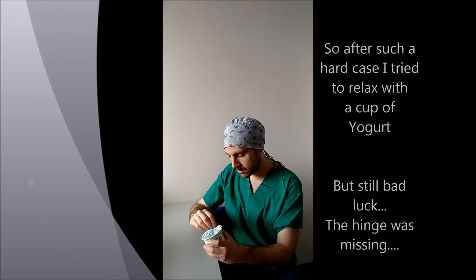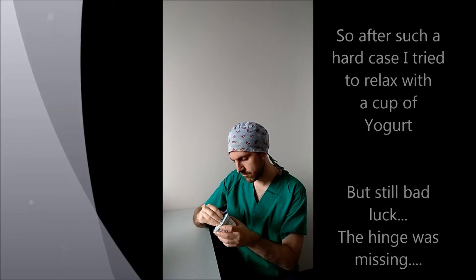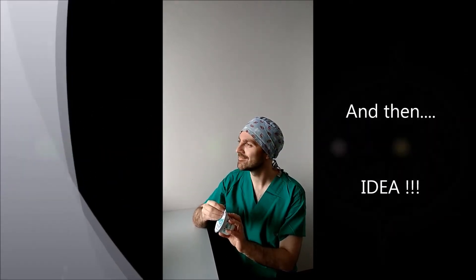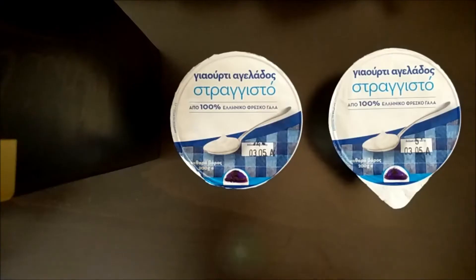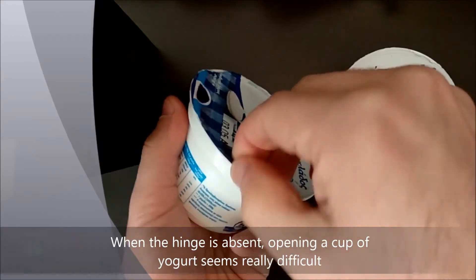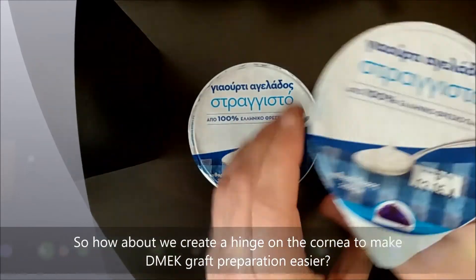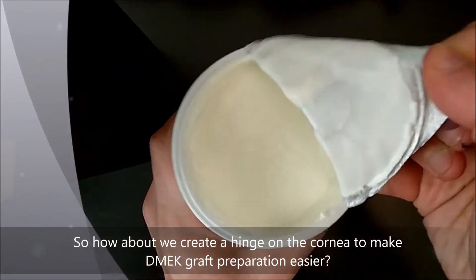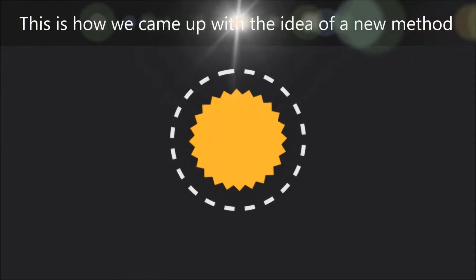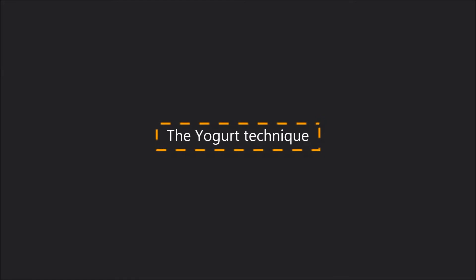So after such a hard case, I tried to relax with a cup of yogurt — but still bad luck: the hinge was missing. But wait a minute. You see, when the hinge is absent, opening a cup of yogurt seems really difficult, maybe impossible. So how about we create a hinge on the cornea to make DMEK graft preparation easier, like in the cup of yogurt? And this is how we came up with the idea of a new method: the Yogurt Technique.